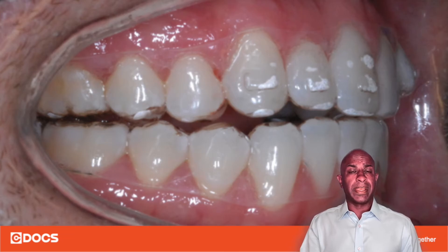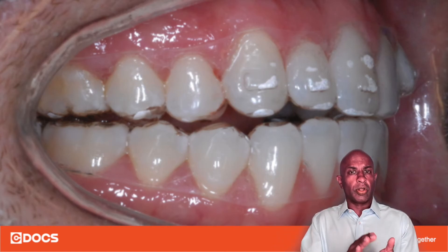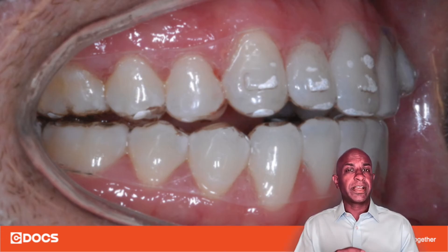You can also use a wax spatula or plastic instrument, wiping it with alcohol gauze, to make sure that you push it in all the way such that the negative attachment well is completely filled with the composite.